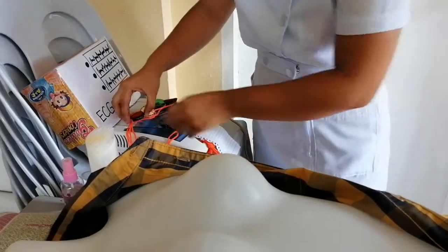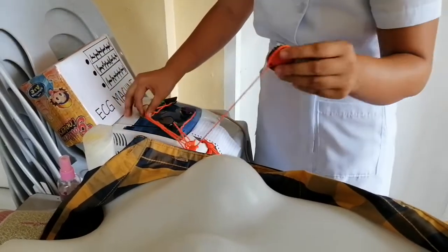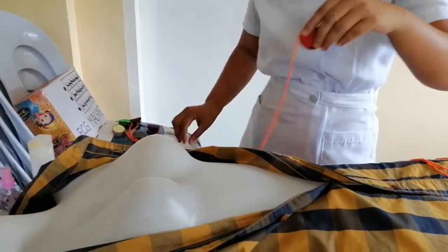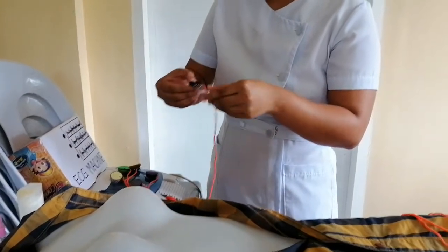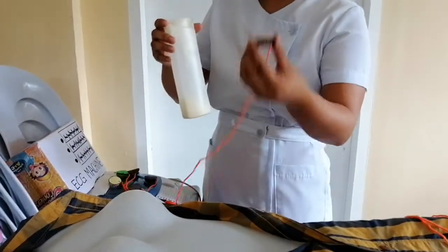So we're going to begin with the red one. So this is what we call the V1.